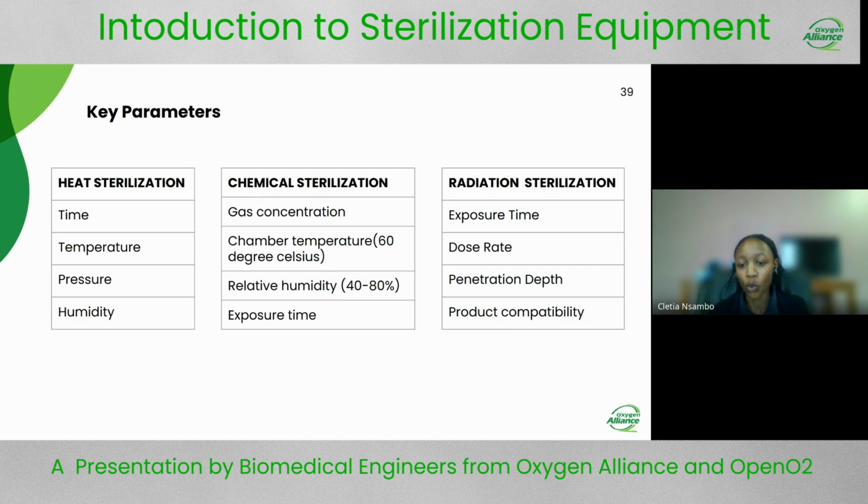It may not have an effective radiation. So for one to have a successful radiation, you need to balance all these parameters. These are just a few. There might be more parameters that you need to also look at.